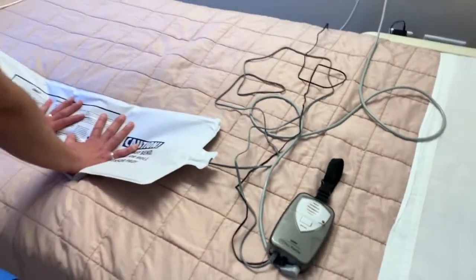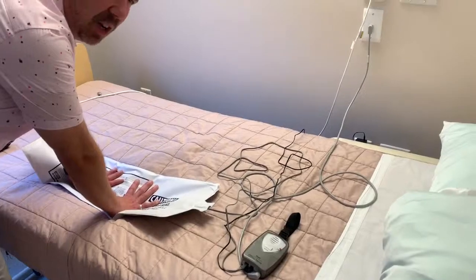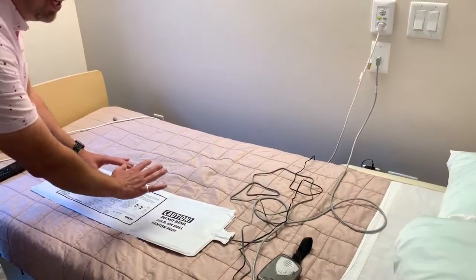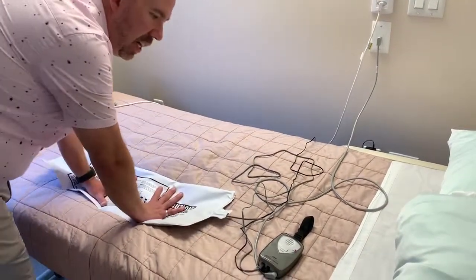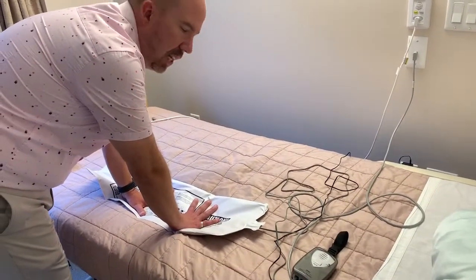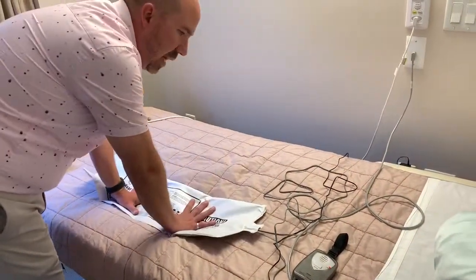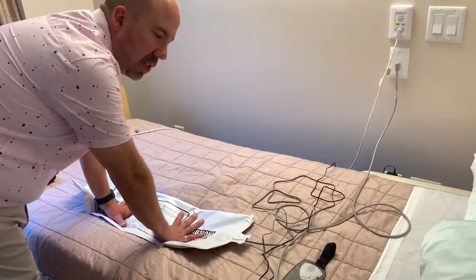So I have this bed exit device set for a 2-second delay. So let's say I'm a resident and I maybe shuffle throughout the night. So let's say I shuffle, I get off for a second there, and I go back on. You see, the thing didn't actually trigger an alarm there, but it gave me an alert when it sensed the weight again. So I can go back down again, and it didn't trigger an alert.